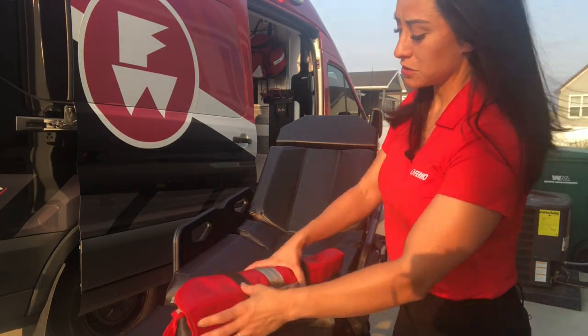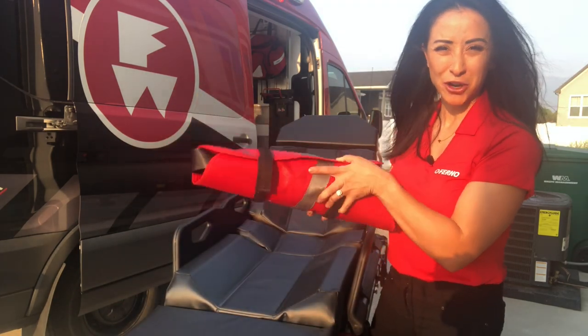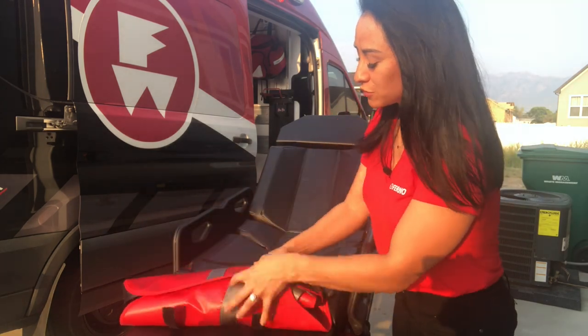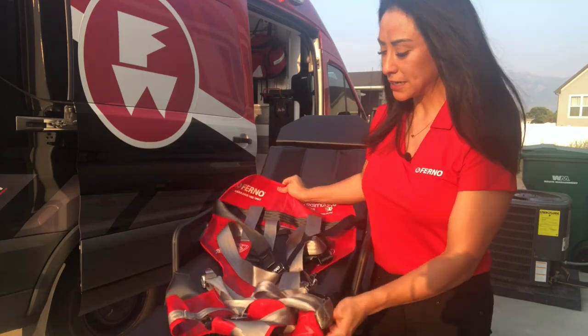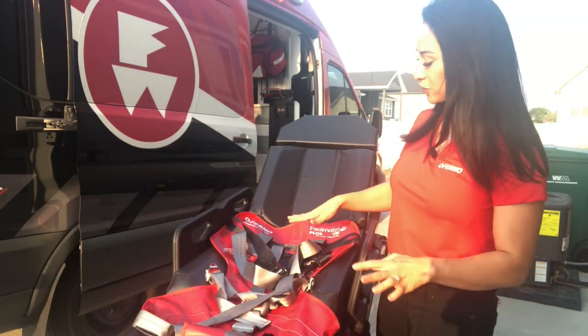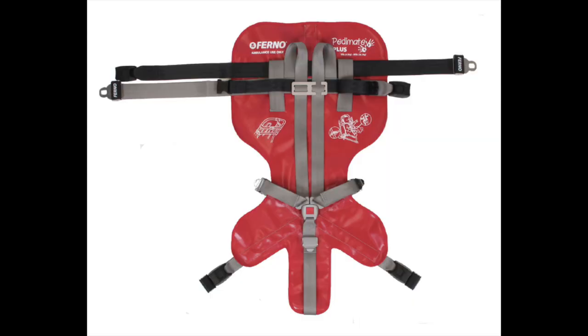So the first thing you're going to do — as you can see, it's in what I call the burrito. It's just easy for storage that way. What you're going to do is go ahead and move the Velcro here and you're going to lay out your PD Mate. You'll see all your straps in here that you need to secure it to the gurney and also to the patient.